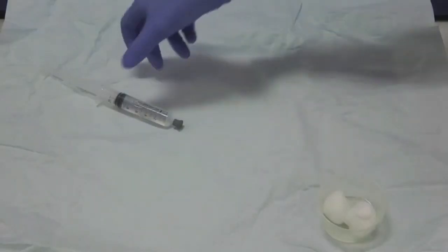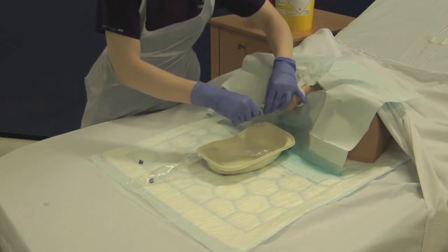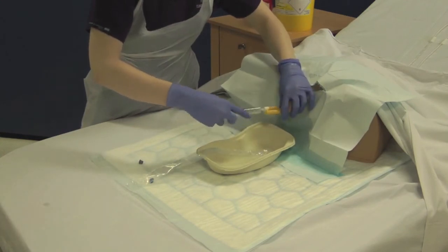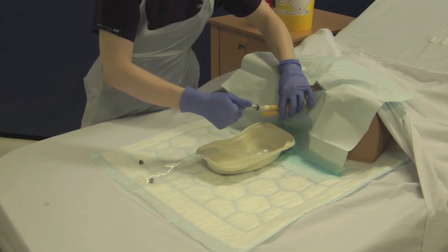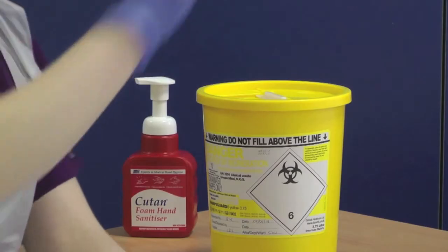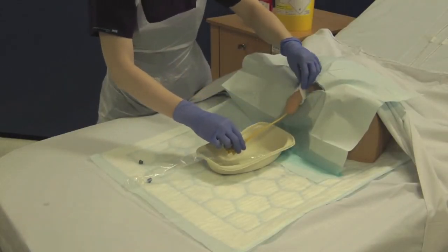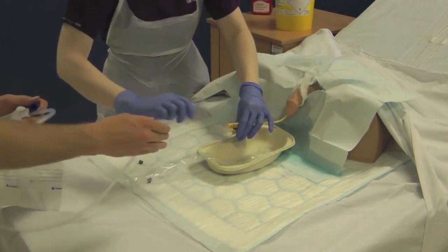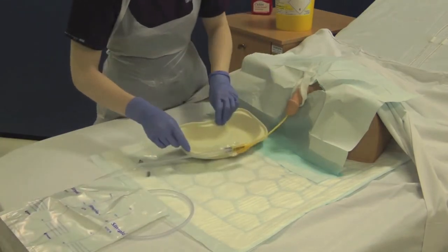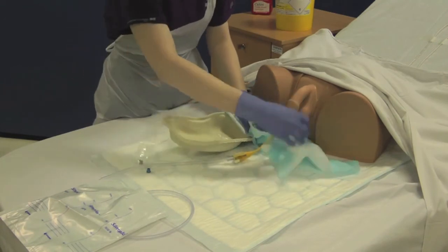Take your 10 ml of sterile water from your sterile field and inflate the balloon, observing the patient for any signs of discomfort. Dispose of the syringe into the sharps bin. Once the balloon is inflated, withdraw the catheter gently to ensure it is secure against the bladder neck. Connect the selected drainage bag. This can then be attached to the patient's leg or catheter stand. Replace the foreskin and remove all waste material.